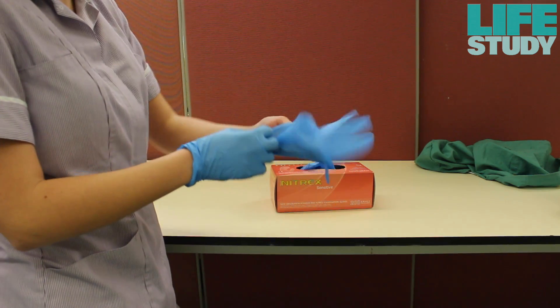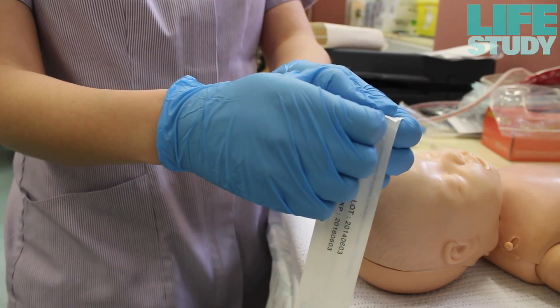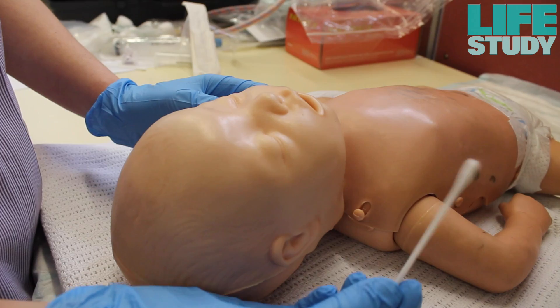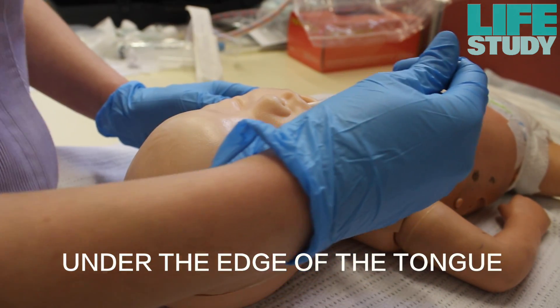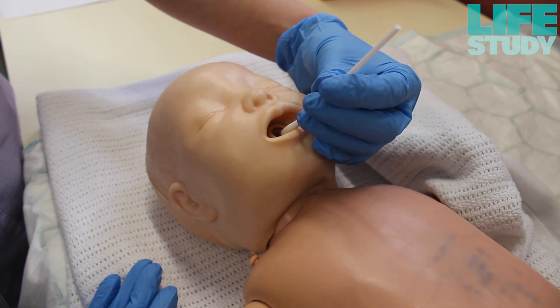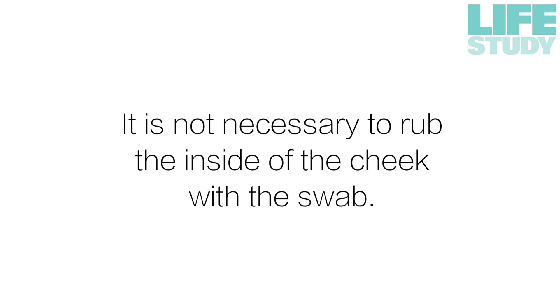Put on the non-sterile gloves. Remove the swab from the sterile packaging, handle end first. Place the swab into the baby's mouth under the edge of the tongue for around 30 seconds, until it is completely saturated with saliva. Please note that it is not necessary to rub the inside of the cheek with the swab.